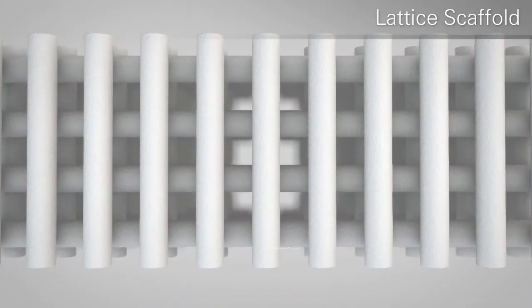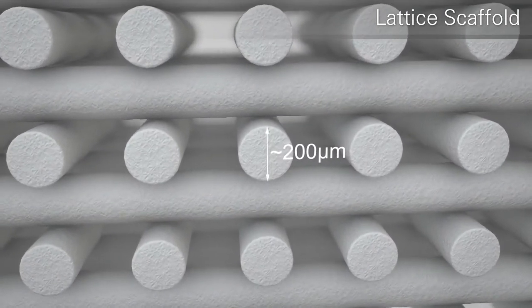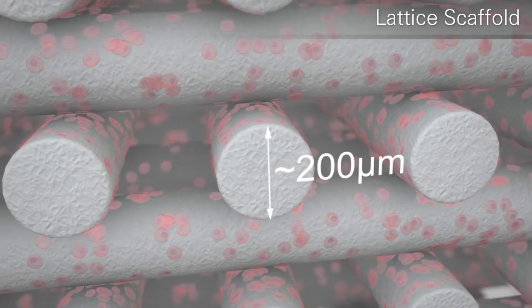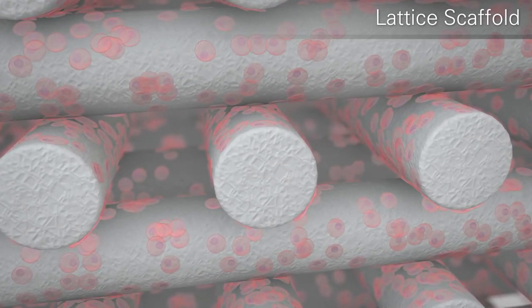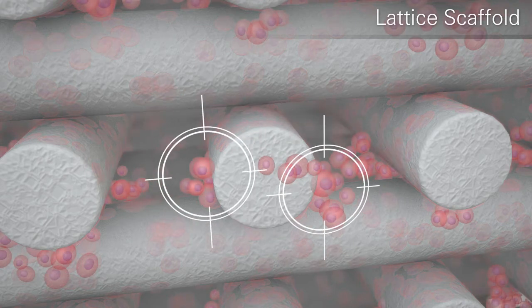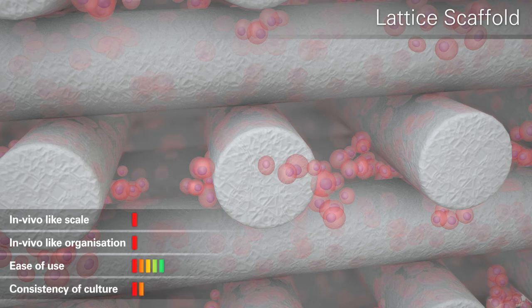Lattice scaffolds are comprised of a relatively large grid-like structure. The scale of the lattice results in cells either falling through the gaps in the structure or forming a two-dimensional monolayer of cells on the surface of the lattice members with only occasional pockets of 3D cell growth. Cell-to-cell interactions are therefore greatly reduced.